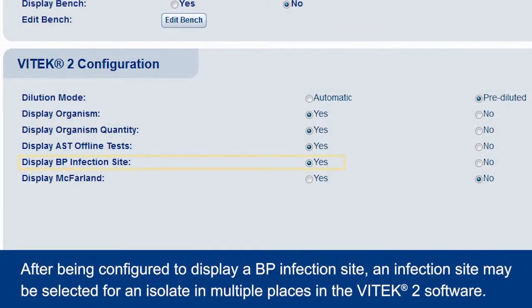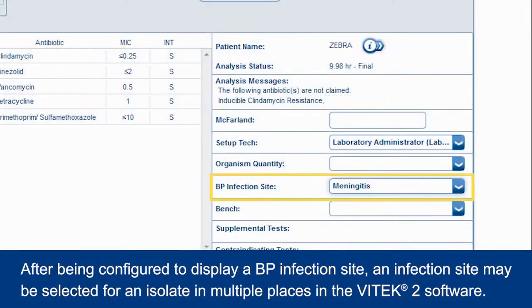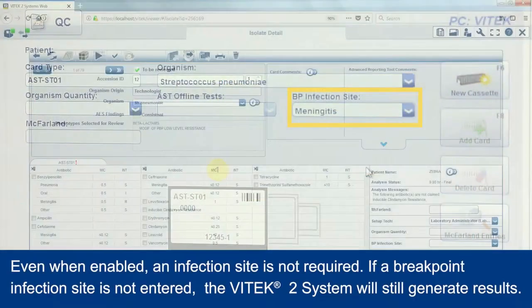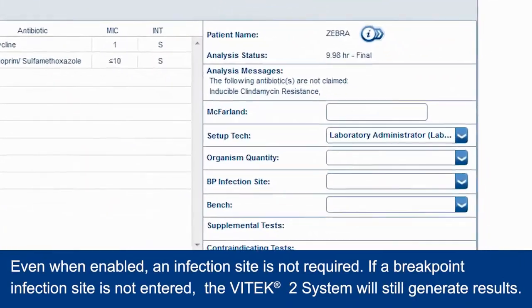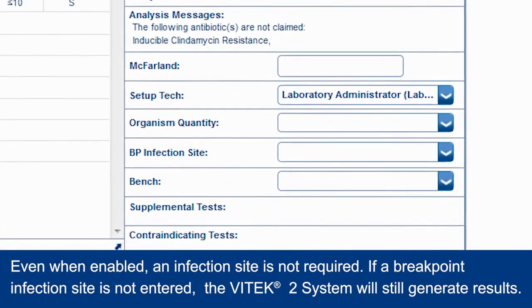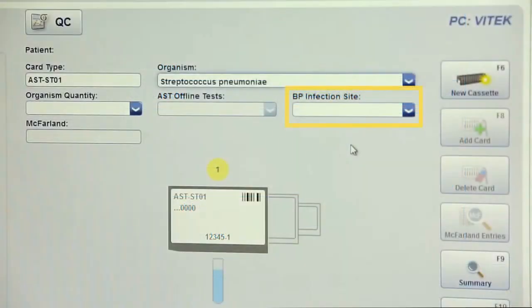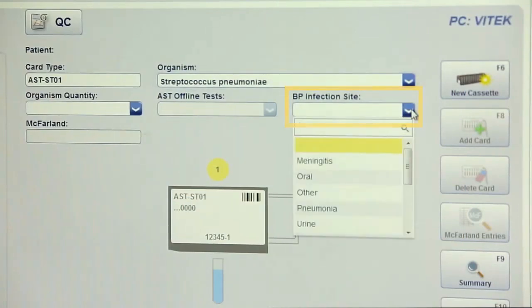After being configured to display a BP infection site, an infection site may be selected for an isolate in multiple places in the Vitec2 software. Even when enabled, an infection site is not required. If a breakpoint infection site is not entered, the Vitec2 system will still generate results. An infection site may be selected during cassette creation in Vitec FlexPrep.